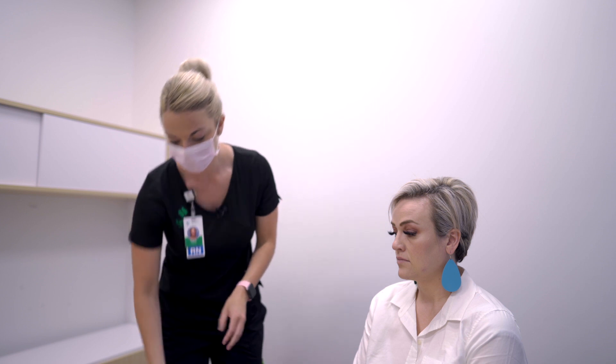Take off your gloves and perform hand hygiene again. You're all done.